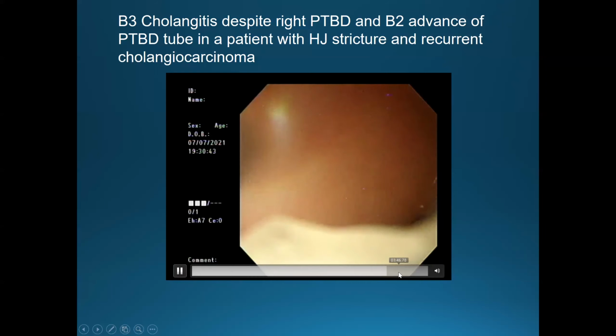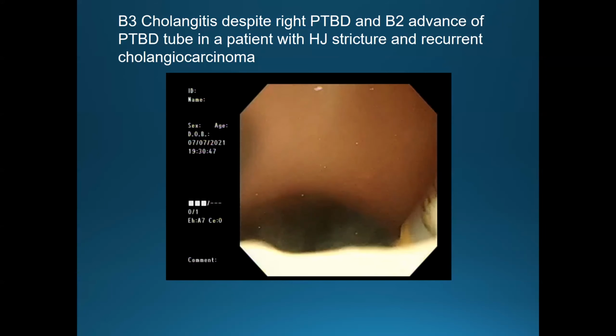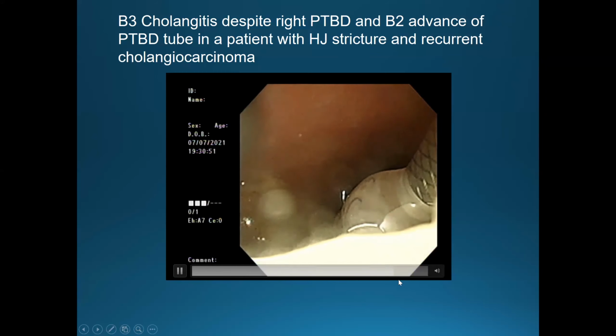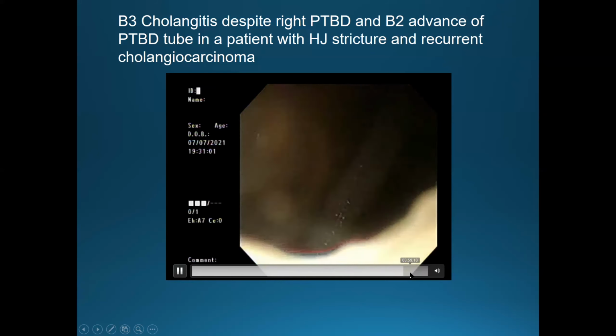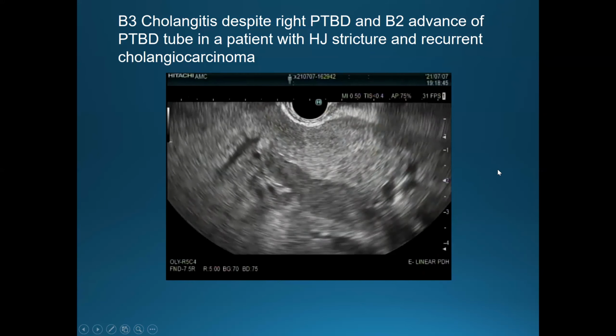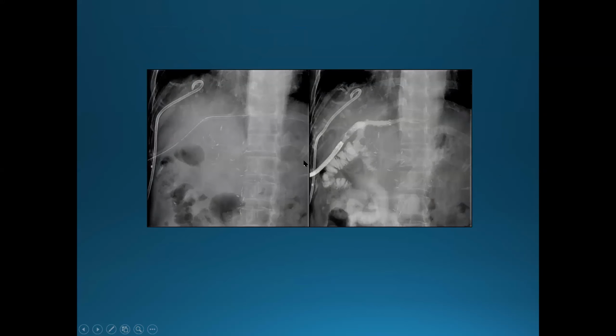Finally, we have some inside working channel. It's a release technique, intrachannel release technique. Pus is drained after the procedure here. Finally, we performed PTBD-assisted anastomotic stenting in the right and left hilum.